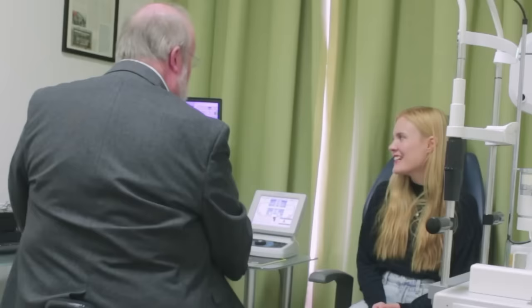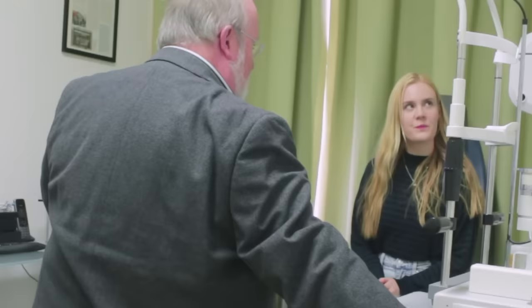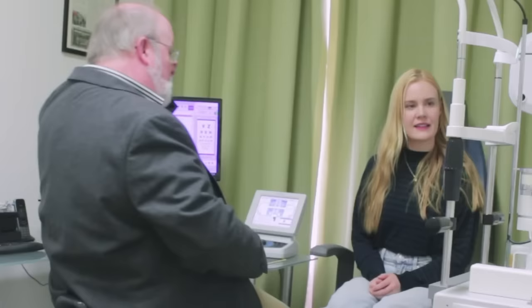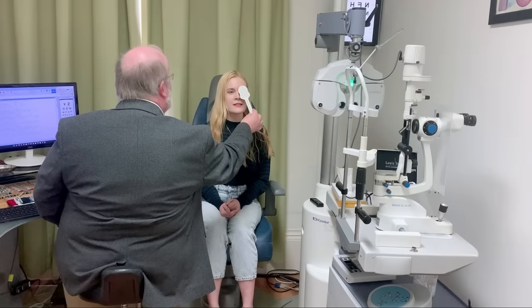Yeah. So shall we have a little look and see what you see today? Okay. So let me take you up a little bit. I'm just going to go up a bit. There we go. And can you see in front of you, there's a mirror? Oh, yes. And I'm just going to cover your eye. There we go. Can you see any of the letters on there? Yeah, I can read the top V and Z. Okay. And then it's R, E, N. Well done. N, N, F. H. Okay. P. Nice.